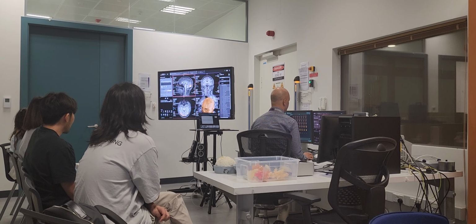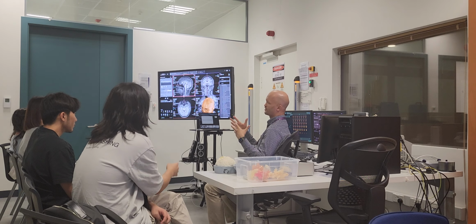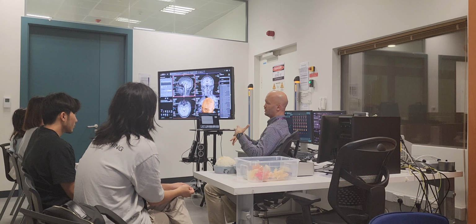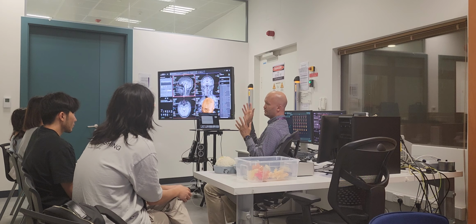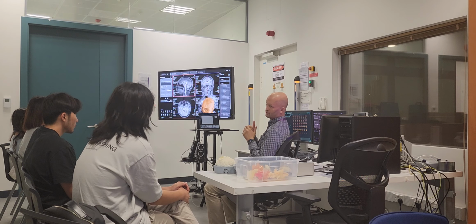We pre-collected high resolution scans for him because the high resolution scans take about 6-7 minutes. So rather than us waiting for 6-7 minutes, we collected the quick localizer so you get the point, and he wants to see. So he's curious.